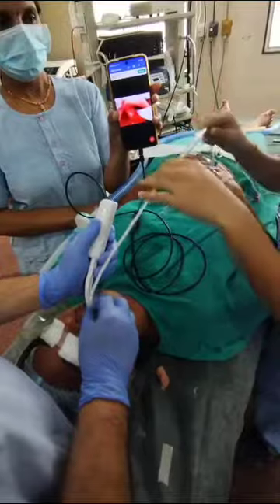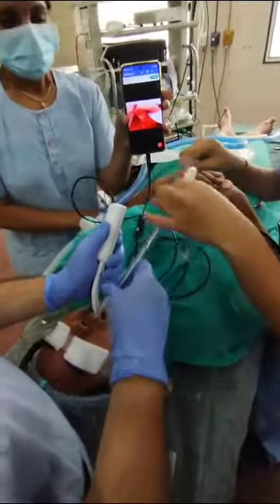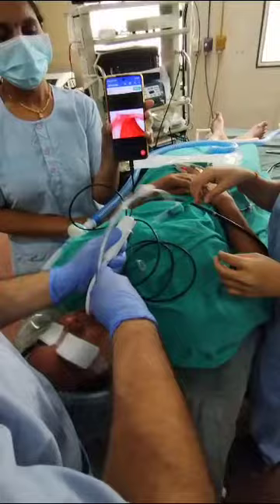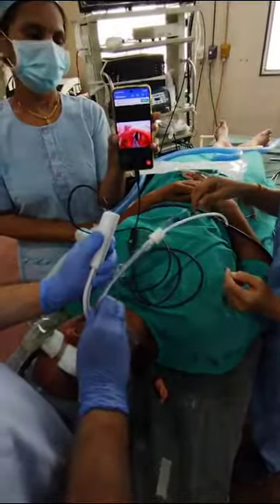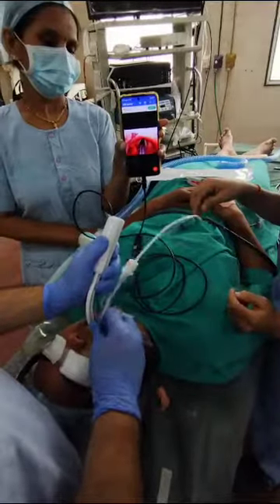The bougie has entered the larynx. Now we are introducing the endotracheal tube, railroading the endotracheal tube over the bougie. See the introduction — the tube is going into the larynx.